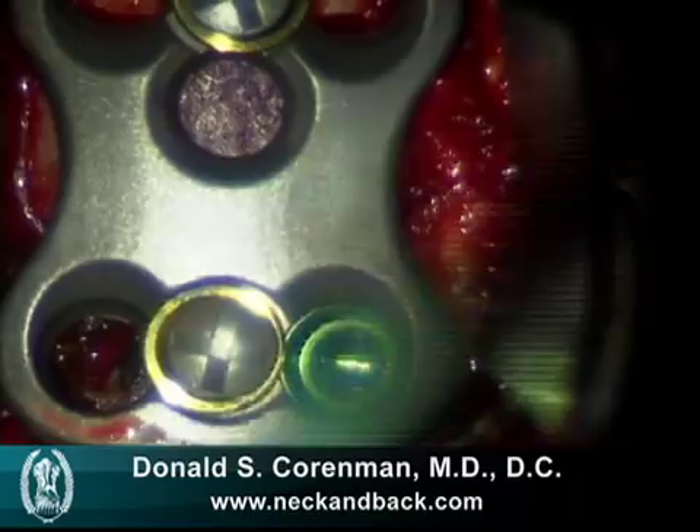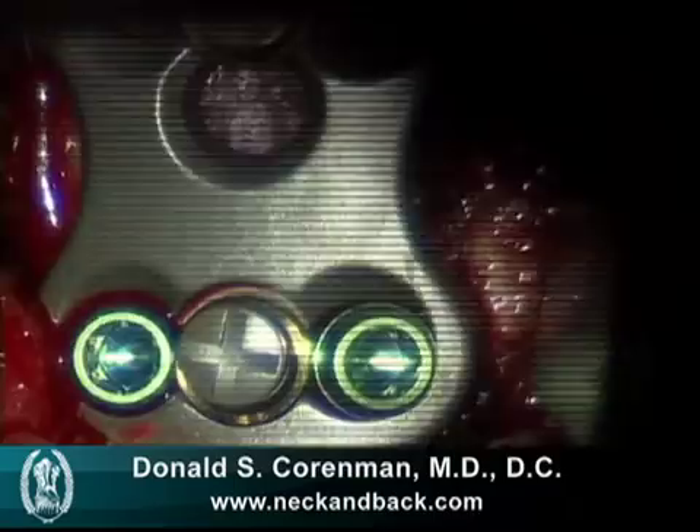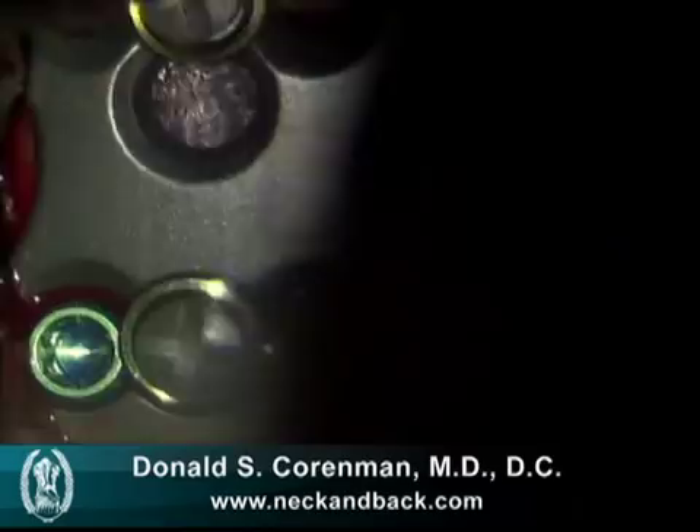Once the screws are placed, we tighten down the swage screw, which attaches the screws to the plate itself — that's the crosshatch screw you see in the center. We'll shortly tighten that, and there we tighten those screws to swage them down.